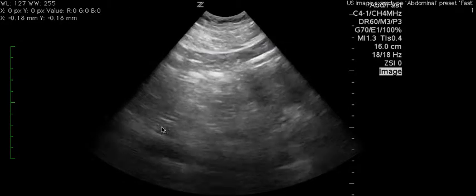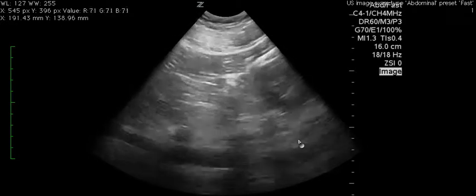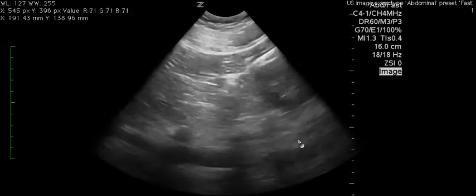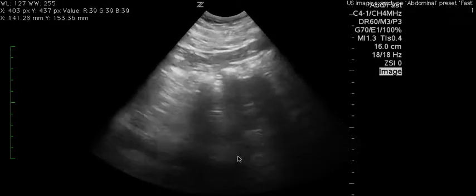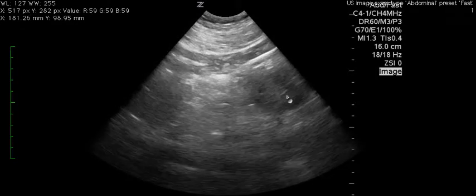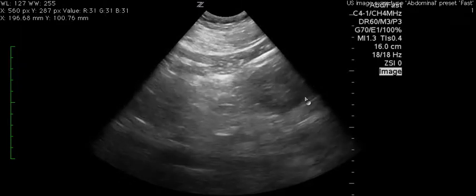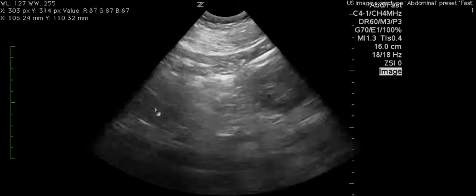This is the left upper quadrant, and as you go through the views, you can see you have the kidney in view, but you don't really see the spleen too well. My guess is that the probe is backwards, because when you get parallel, you can see that you have a nice view of the spine, but you don't see the spleen. You should see the spleen, and you have the kidney here. I wonder if the spleen is over here on this part of the screen. That would indicate to me that the probe is both backwards, and you need to go a little bit more towards the patient's head to improve your images.